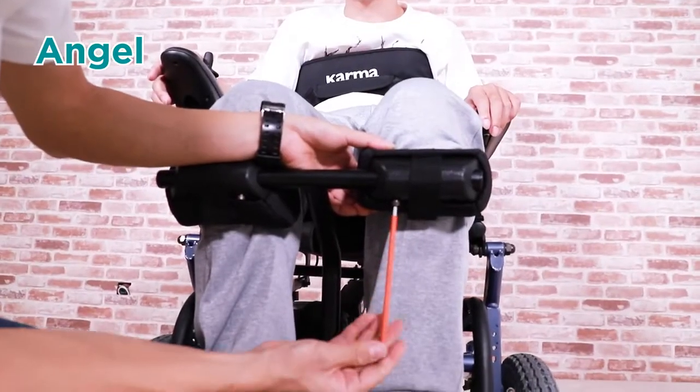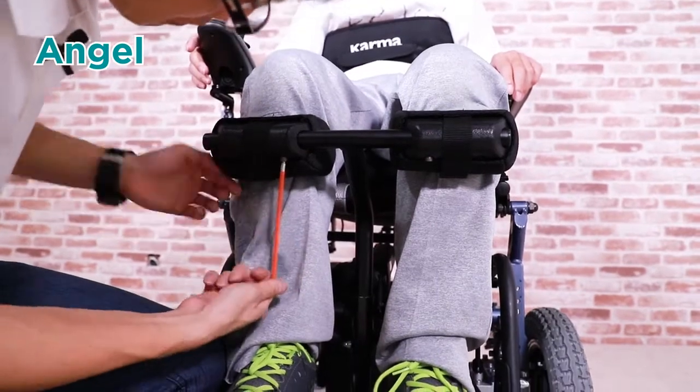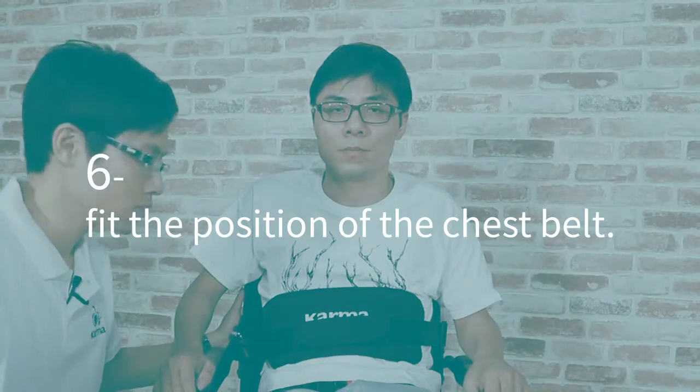Okay, now we tighten up the bolts from both sides. The last stage of fitting is the position of the chest belt. For a user who has weak trunk control, we need to make sure that the chest belt is nicely secured. Otherwise, he might lean forward while standing up.